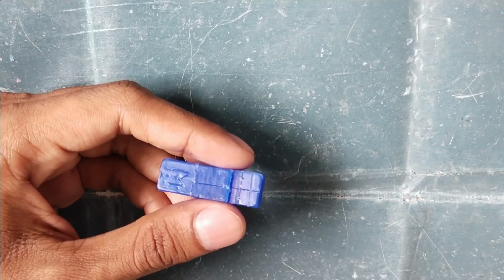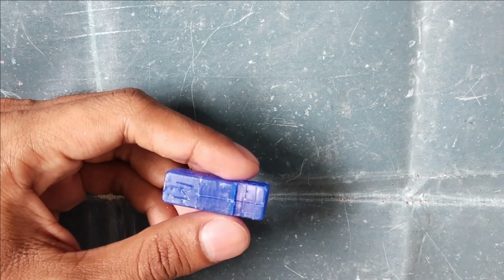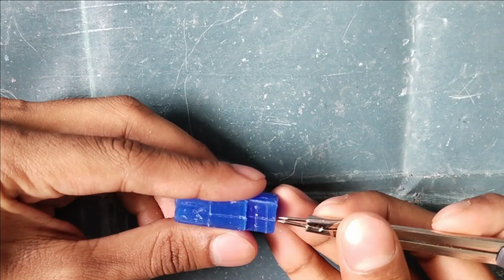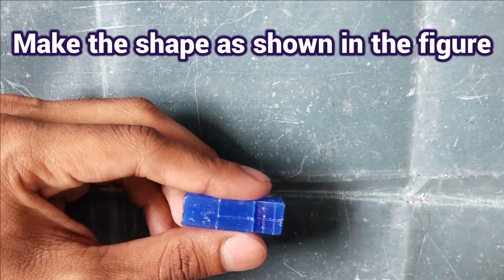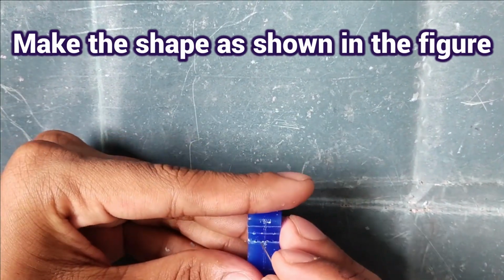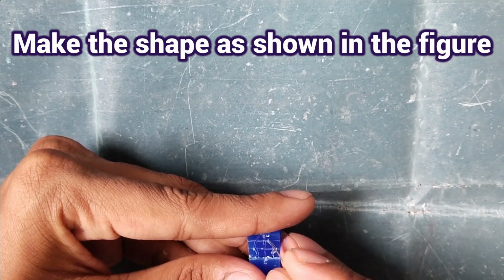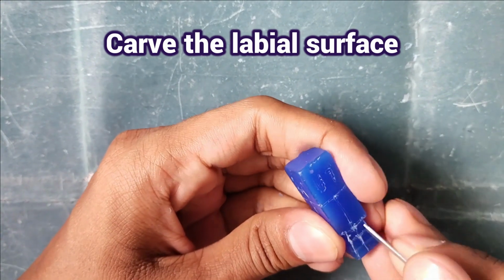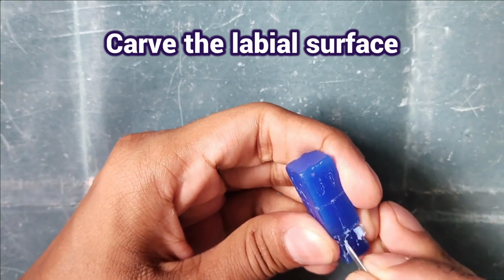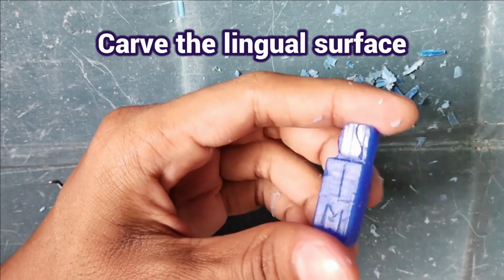Incisor edge is bisecting the midline, so we will take 1 mm on both sides of the midline. Now join all the points. Now carve the labial surface. Now carve the lingual surface.